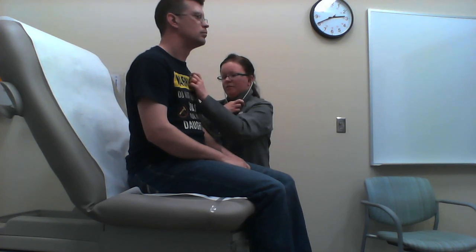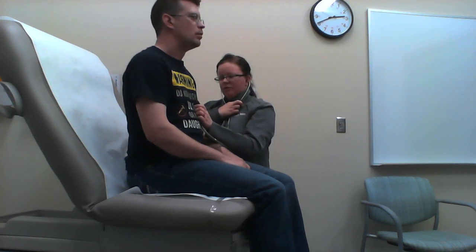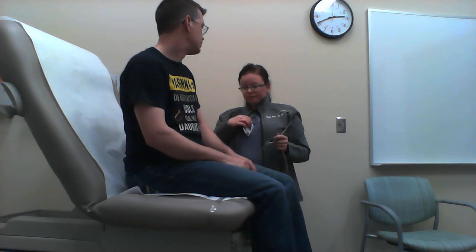Pulmonary. Erb's point. Tricuspid. Mitral. S1 and S2 are normal everywhere.